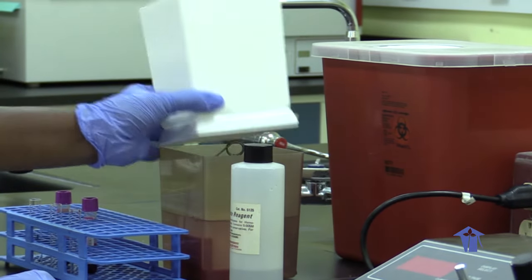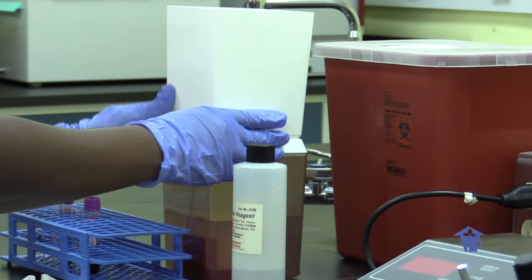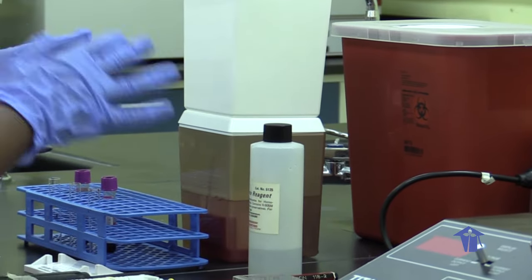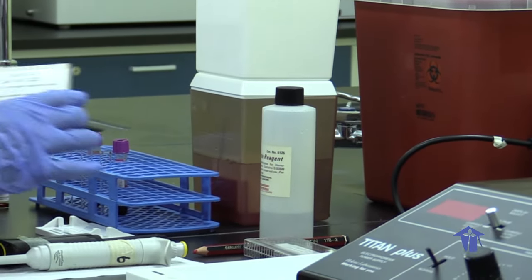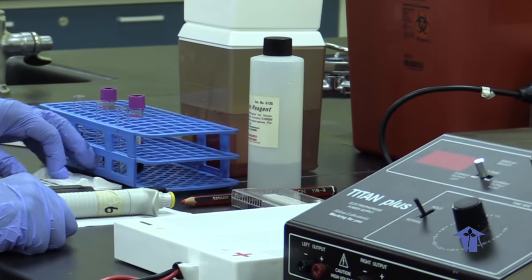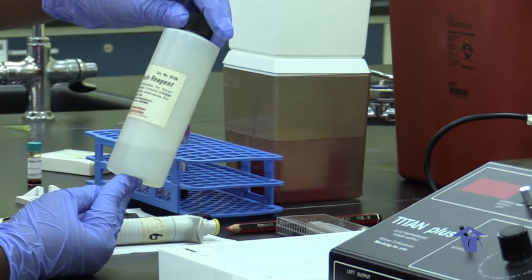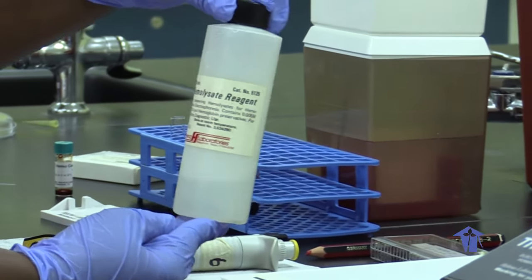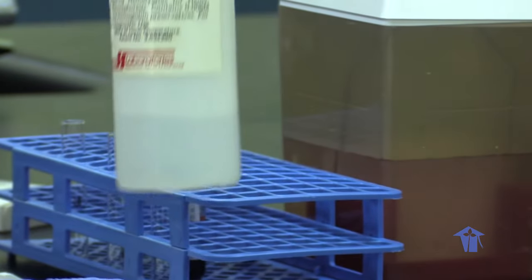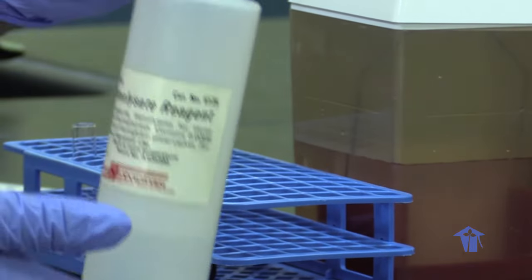We don't ever just immerse it into the buffer. So that's the first thing we need to do when we're setting up. Let our plates soak in advance, using the cellulose acetate plates. Then we obtain our samples and our hemolysate reagent. This is used to lyse the blood cells, because basically we want the release of the hemoglobin inside of the red blood cells, because that is what we are going to analyze.